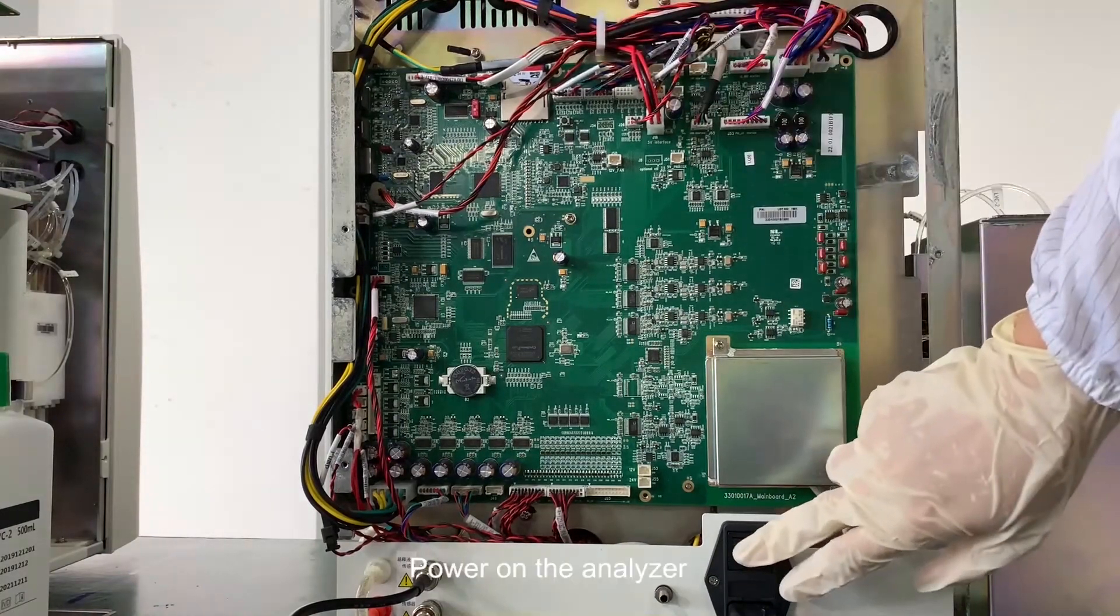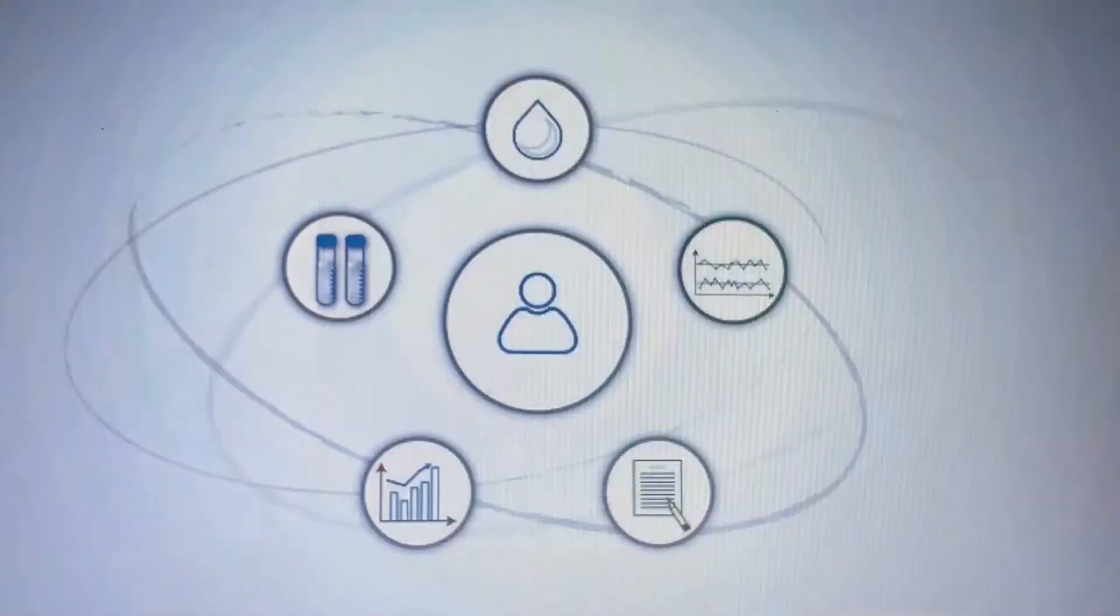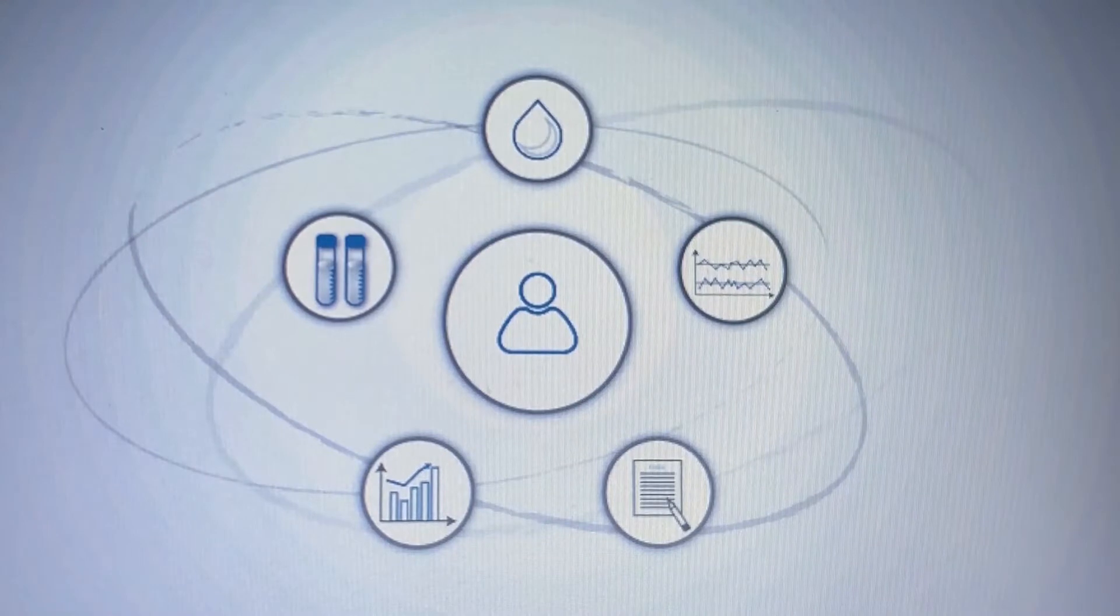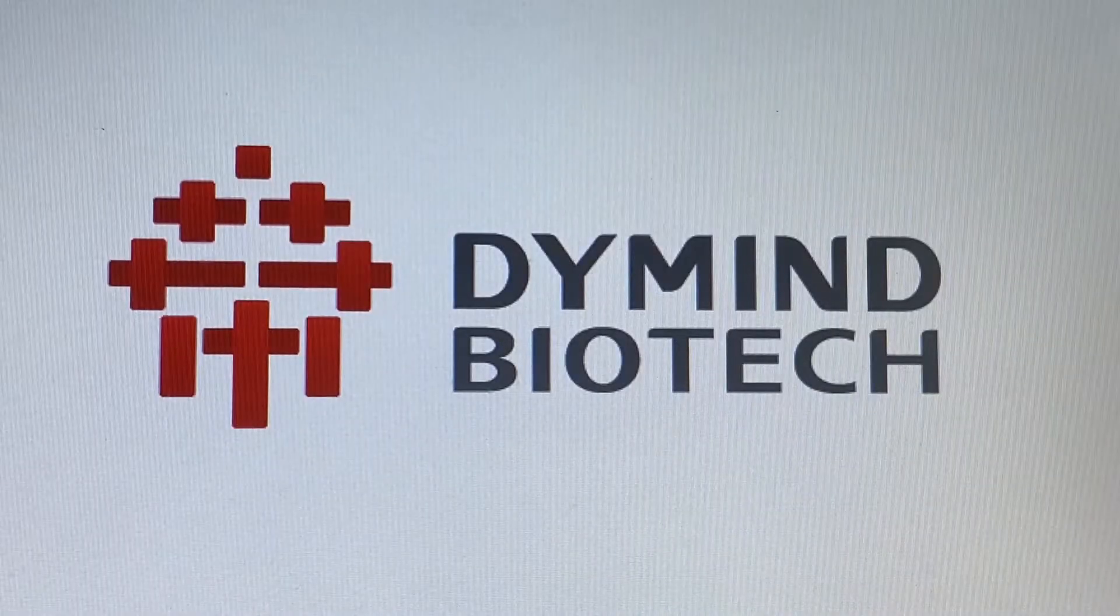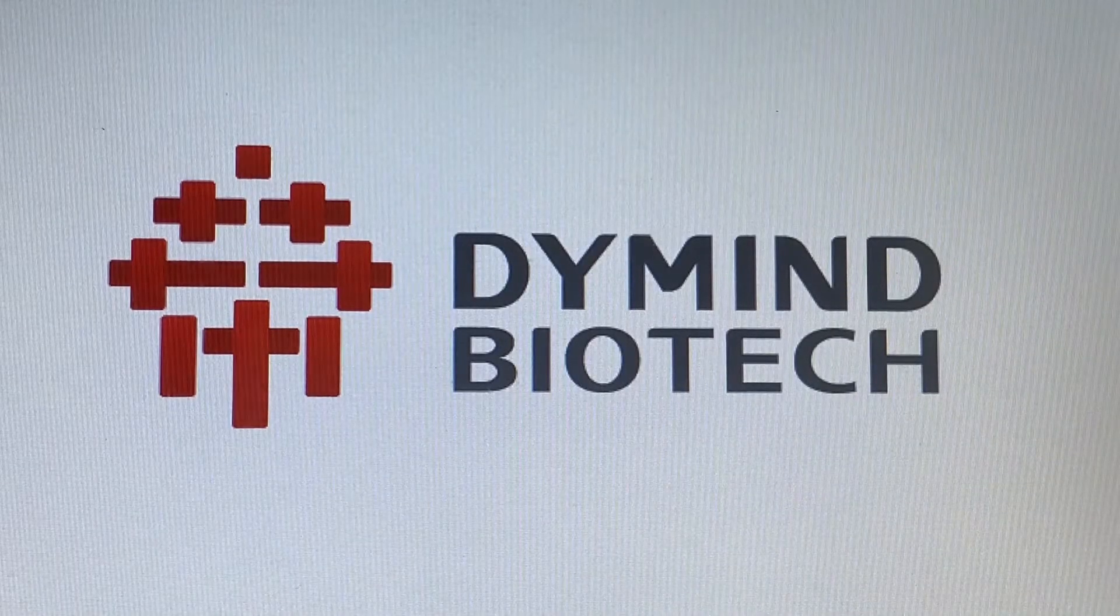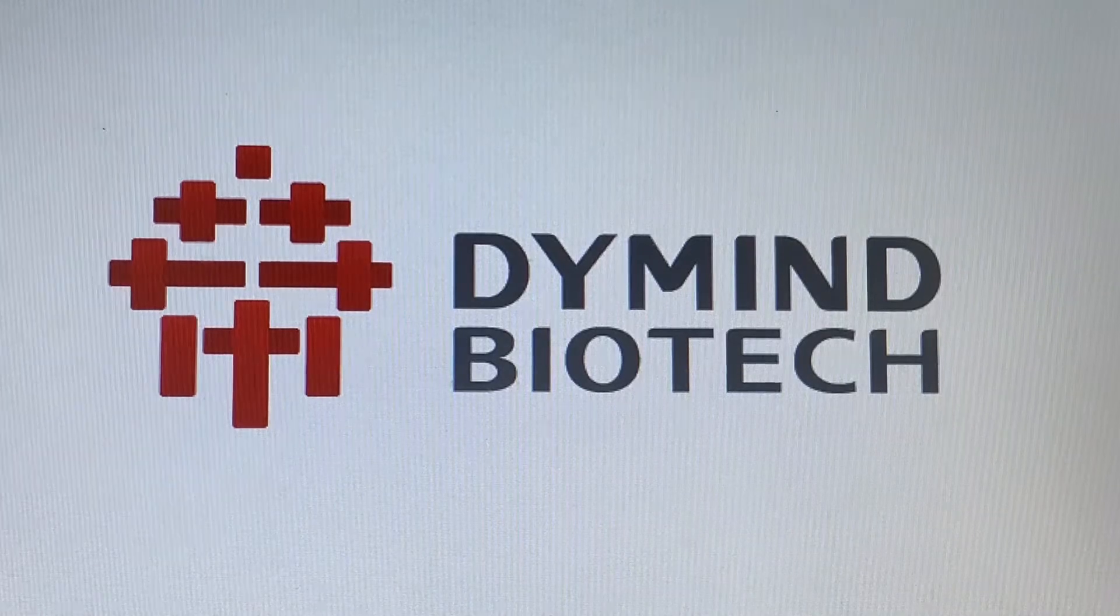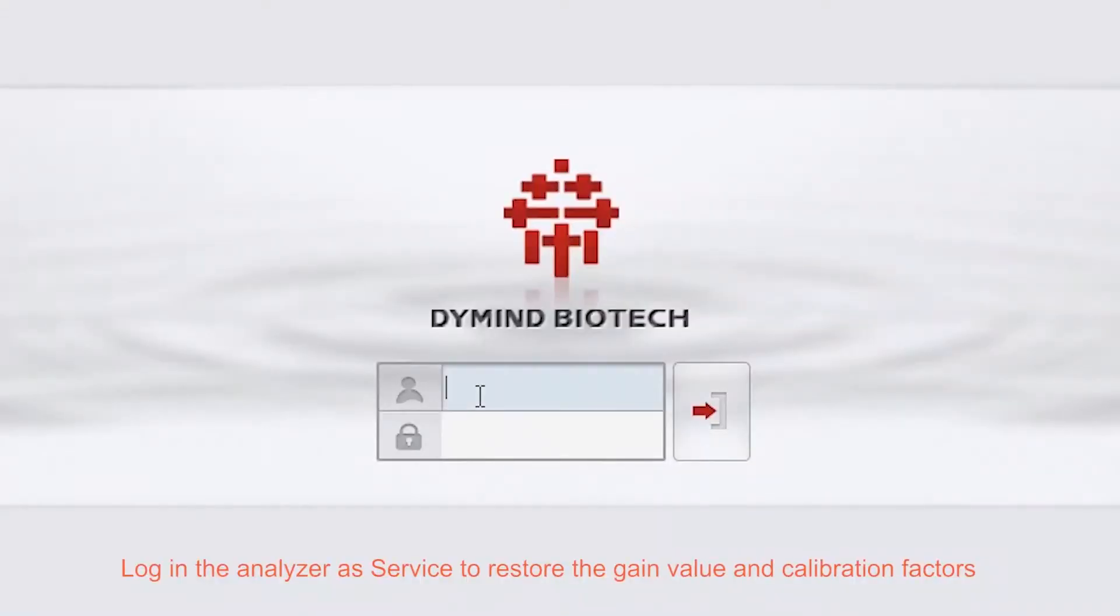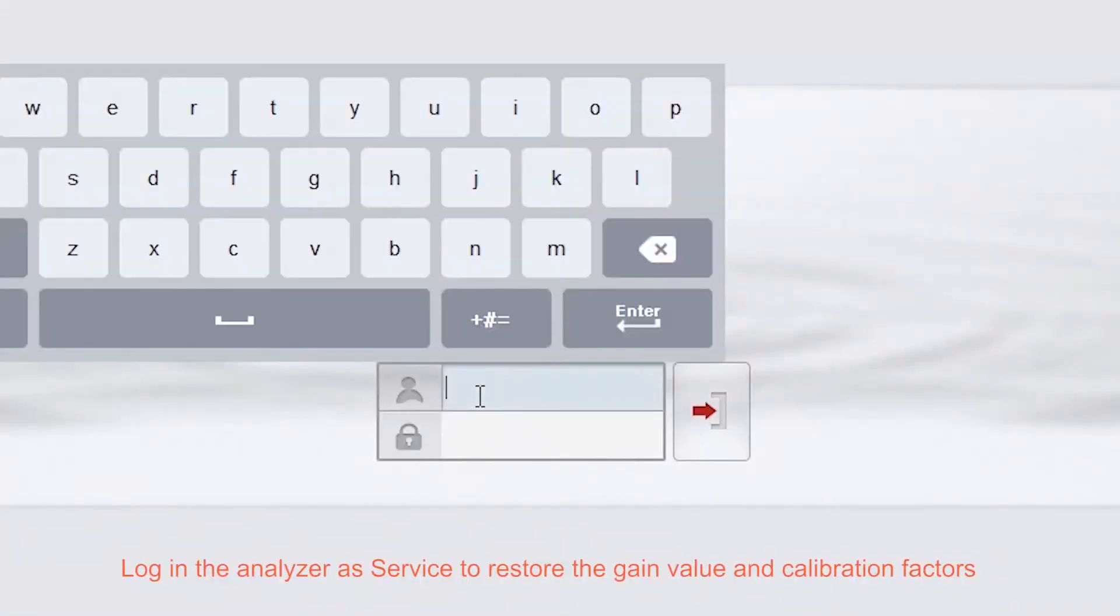Power on the analyzer. Log in the analyzer as service to restore the gain value and calibration factors.